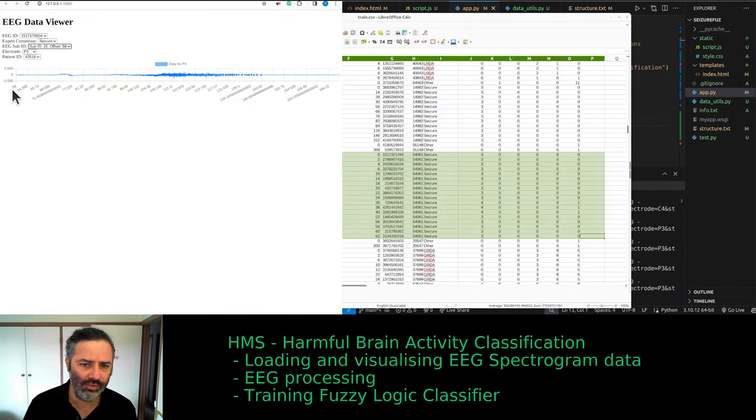So it should be 58 to 166. That doesn't make sense. That's over 100. So we need to fix that. But the point is, yeah, it does the offset to begin with. They're heavily overlaid on top of one another. 62. Yeah, I'm not convinced. I think it's just displaying the same data all the time. It's just changing the x-axis.